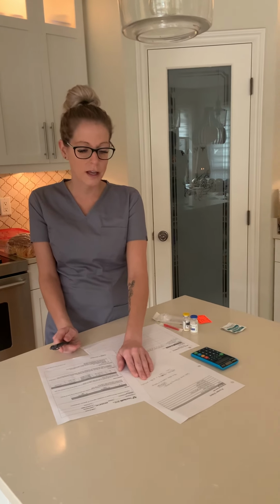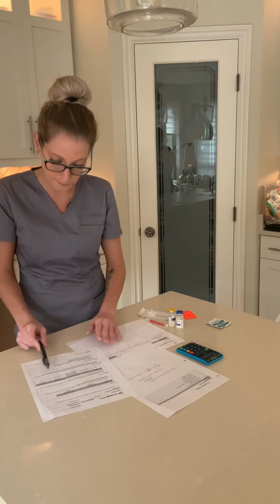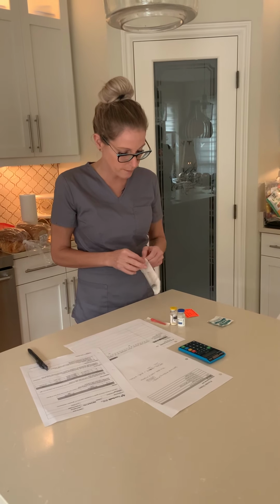I am also going to draw up an extra mil just to account for the 0.55 cc's that's going to go into the line and to ensure that I do have enough medication to deliver to my patient. So I could say 3.5, even up to I think 4 would be acceptable, because again the pump will allow that only the 2.4 mil go into my patient. So first thing I am going to do is some hand hygiene, and I'm going to get to my syringe.